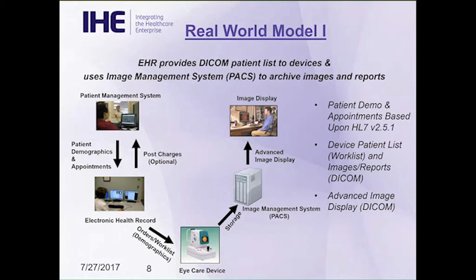As I mentioned before, we have multiple systems, right? And things typically start, of course, with a practice management system. So what we have here now is the ability to manage both patient demographics and updates, and also appointments. And that information is going to use the HL7 standard, and that's going to interface to an electronic medical record system. And as an option, but a very important option, is the ability to post charges so you can deal with billing between those 2 systems. Again, that uses HL7 standards. So this is how the workflow starts.